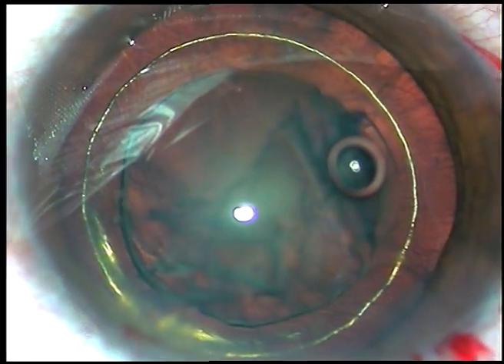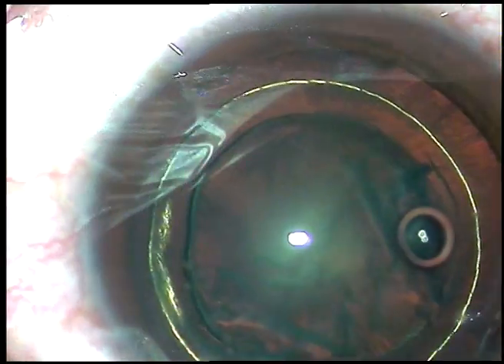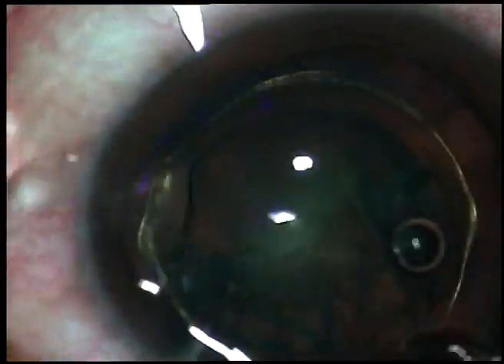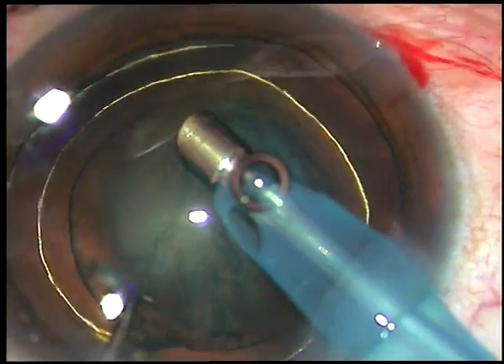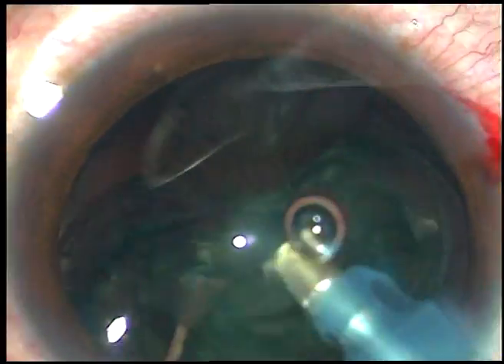This is the phacoemulsification machine. The tip is introduced into the anterior chamber, bevel down, and with vacuum the lens matter is aspirated within a few seconds.